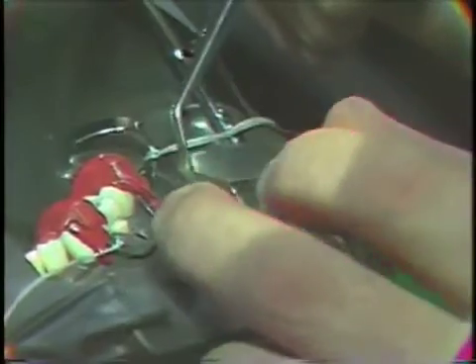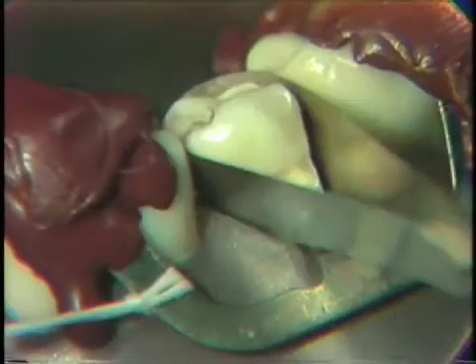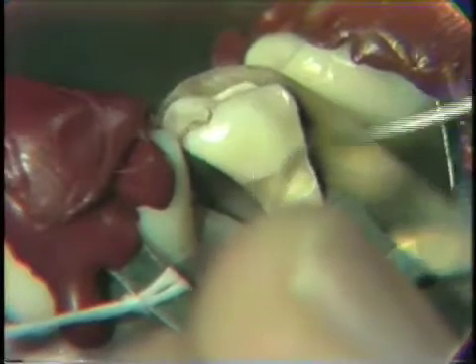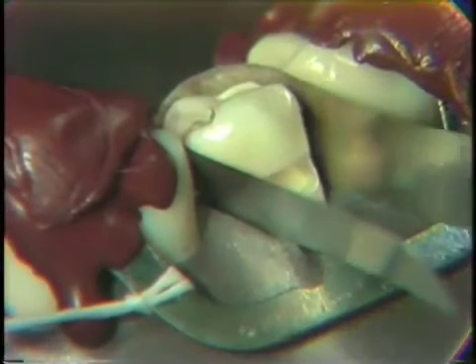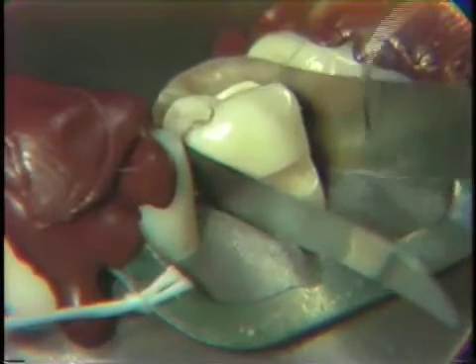Selecting a piece of matrix material and applying it to the tooth for trial, one can insert it, pulling it snugly, and then with an explorer mark or score the sides of this matrix so that it may be trimmed appropriately.